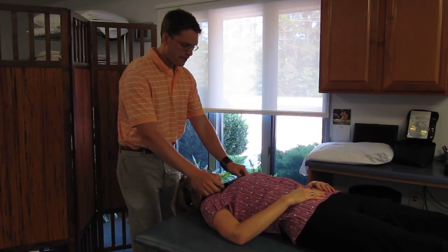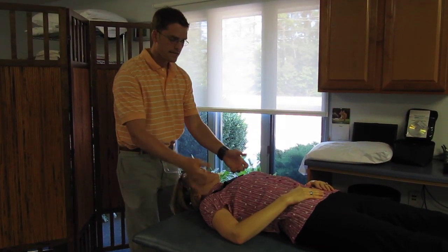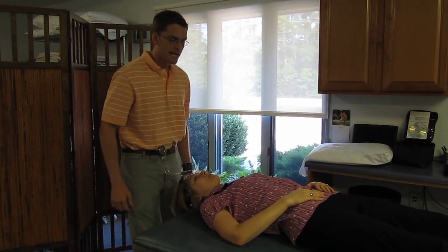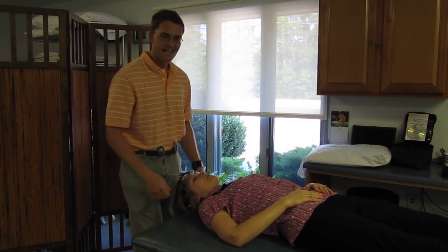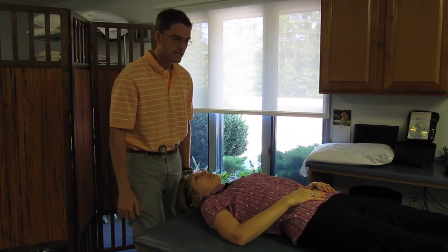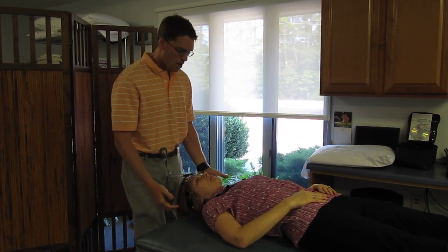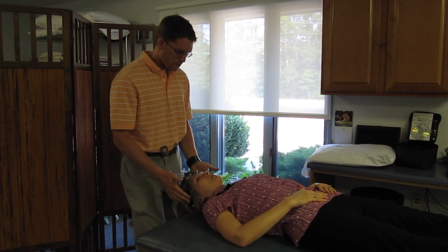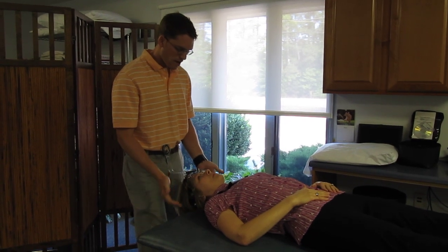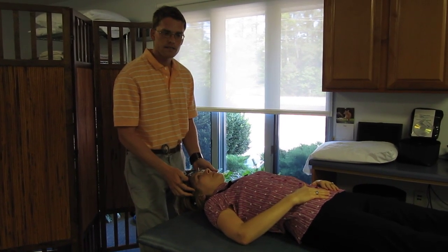I'm going to show you the flexion rotation test. This test is designed to test C1 or C2 dysfunction. And what you want to use for objectivity is the CROM device.